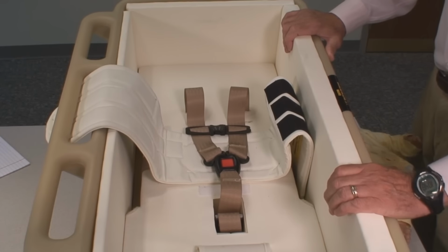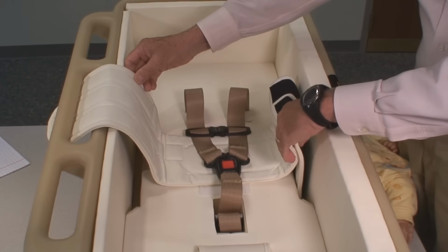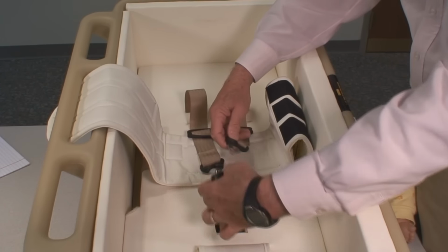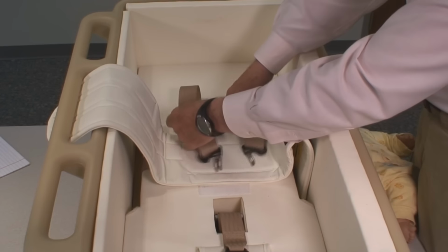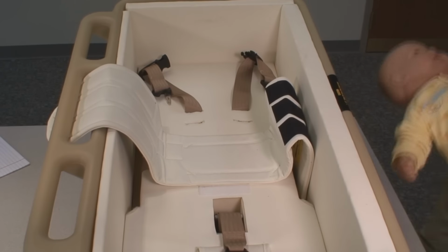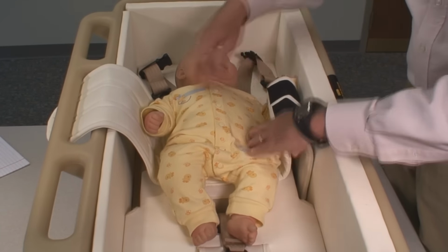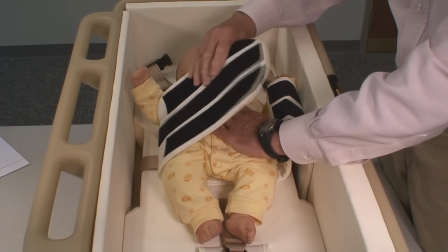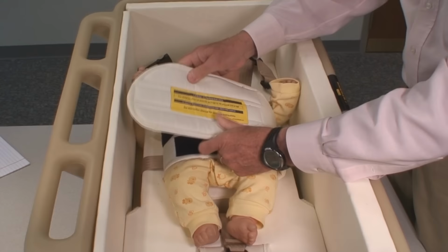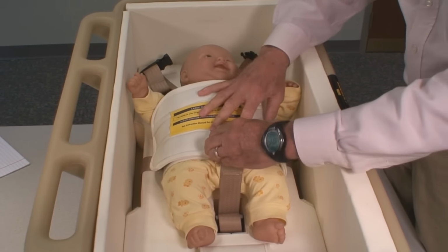Okay, we're now ready to install the child in the 3-point harness. Again, the cummerbund is in position under the 3-point. You disconnect the buckle, lay the buckle aside, disconnect the chest clip, lay it aside, and lay your child on top of the cummerbund. You must always use the cummerbund when you're using the 3-point. It's mostly designed for keeping the child in position and protecting the child from the buckle hardware.